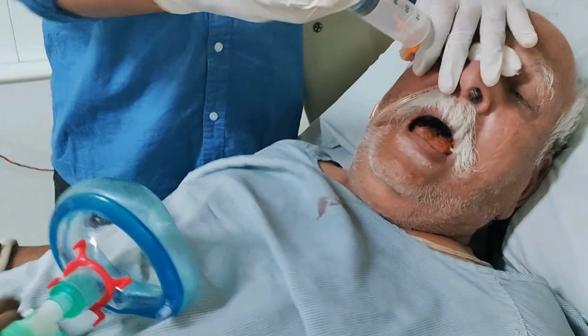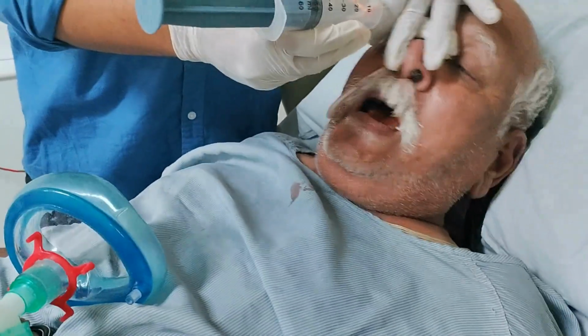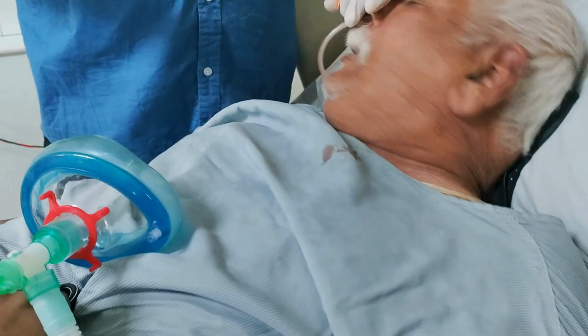Alternatively, you can inject a small amount of air into the tube and listen for a whoosh sound using a stethoscope over the stomach. If you hear the sound, the tube is correctly placed.